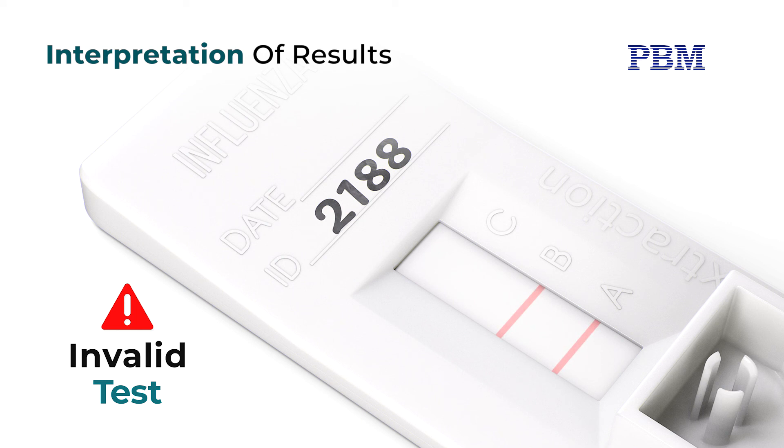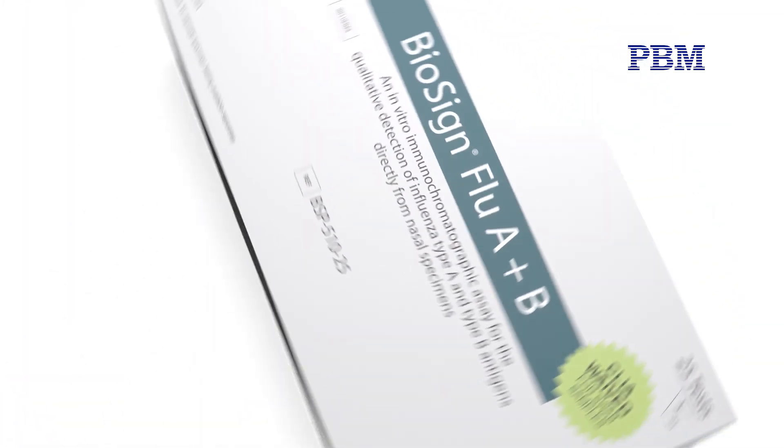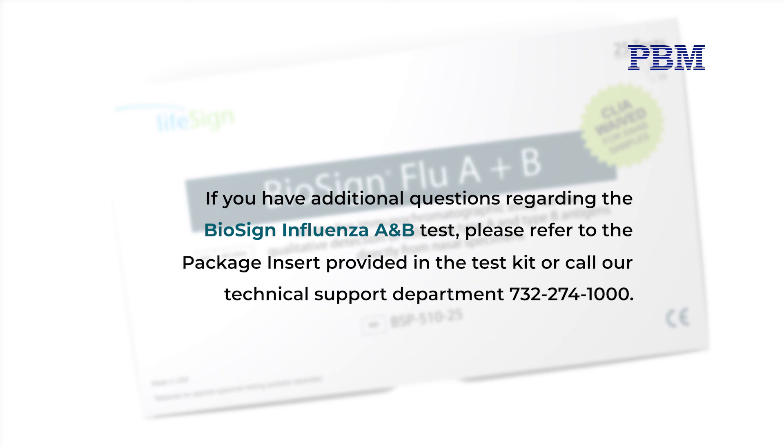Once the test is completed and patient results have been recorded, dispose all testing material used in the appropriate waste container according to your state and local biohazard waste disposal guidelines. If you have additional questions regarding the BioSign Influenza A and B test, please refer to the package insert provided in the test kit or call our technical support department at 732-274-1000.